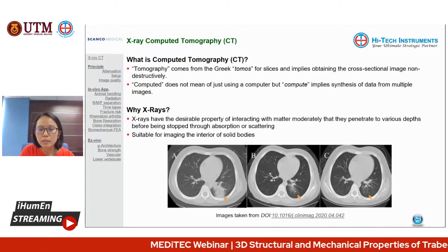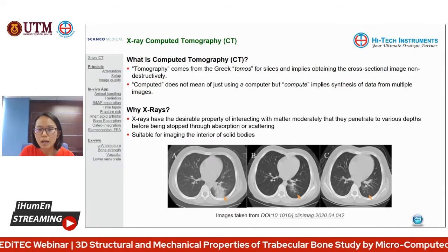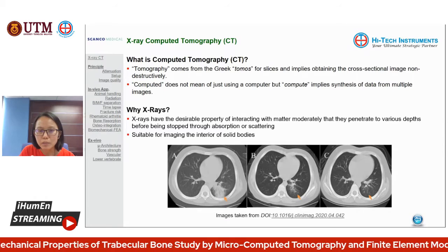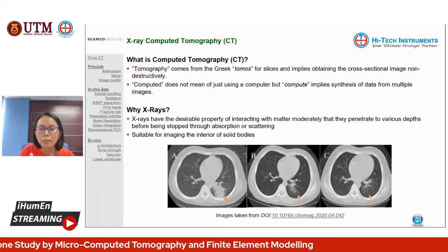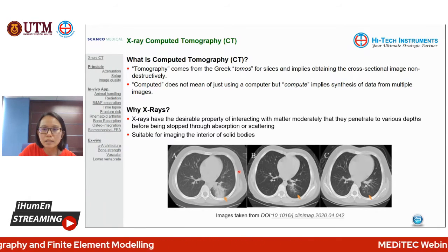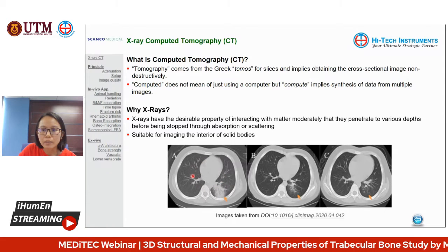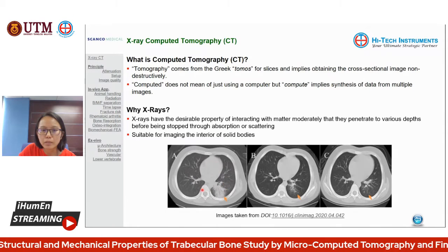So here I've got these CT images. I believe some of you might have seen similar images. It's a 7-year-old female patient with COVID. You can see here the axial CT images, and from here you can see the consolidation in this part, the lung lobe here, with a higher density and with a blurred boundary.